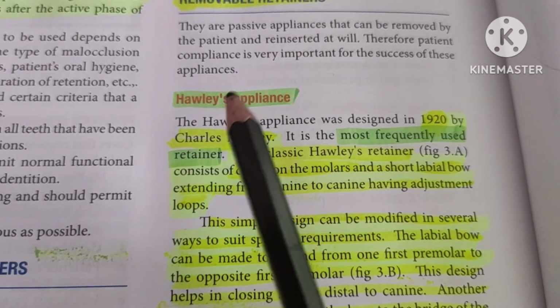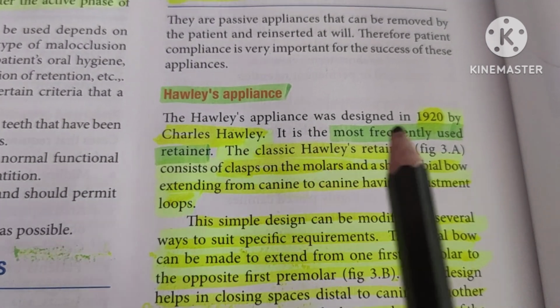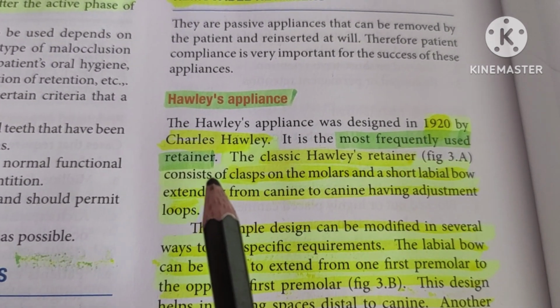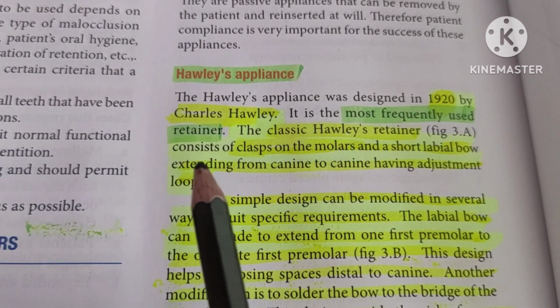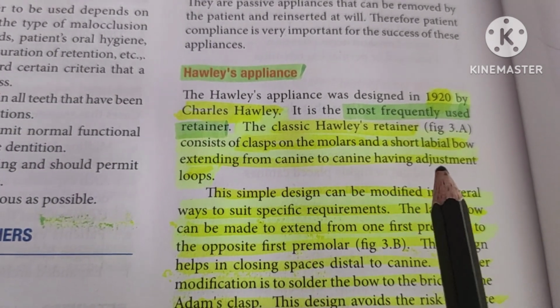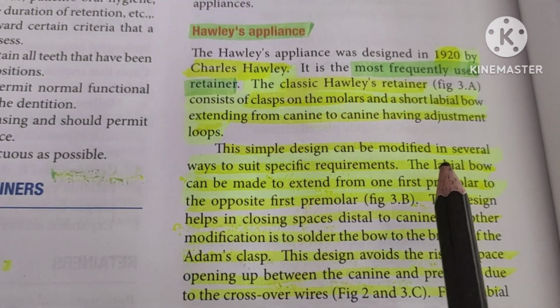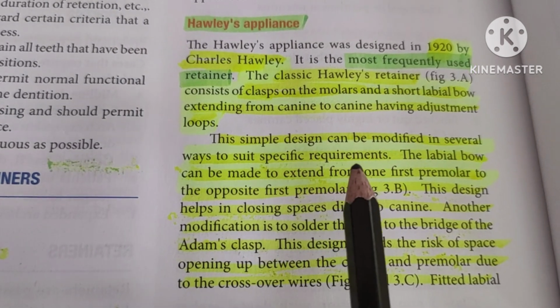Hawley's appliance. The Hawley's appliance was designed in the year 1920 by Charles Hawley. It is the most frequently used retainer. The classic Hawley retainer consists of a clasp on the molars and a short labial bow extending from canine to canine, having adjustment loops. The simple design can be modified in several ways to suit specific requirements.